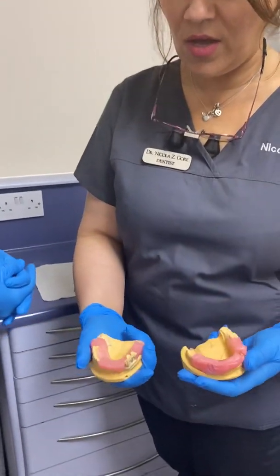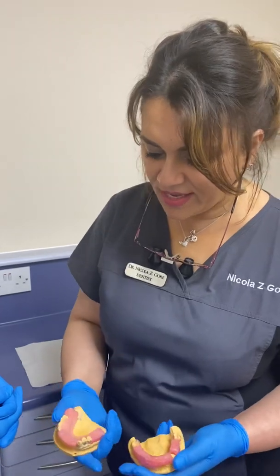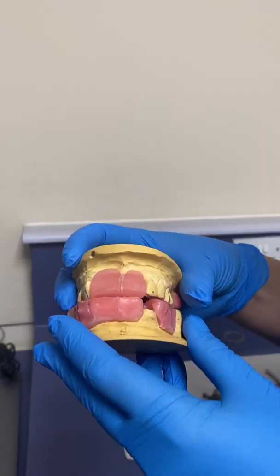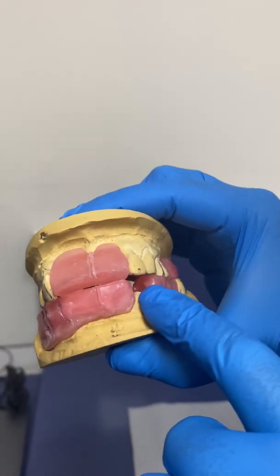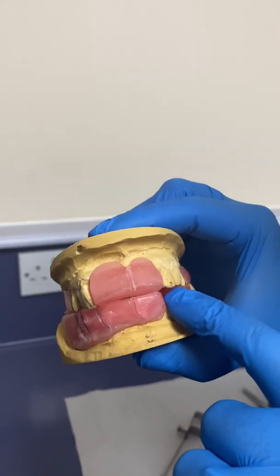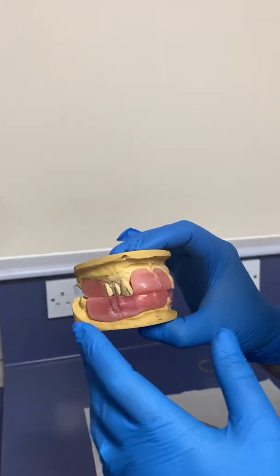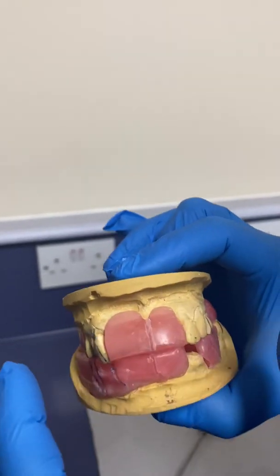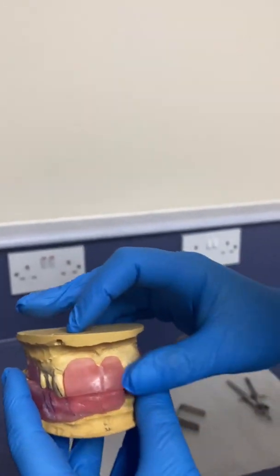We also ask the lab for wax rims. We've got the upper and lower occlusal wax rims back from the lab. This patient is actually partially dentate, and together with Kavita today we did a jaw registration for her. This tooth is broken, but we found a point of reference with the original tooth here and here, so we managed to keep that reference. We increased her freeway space by two millimeters and gave her a little open bite. We also added some wax labially so she'll have a better lip profile.